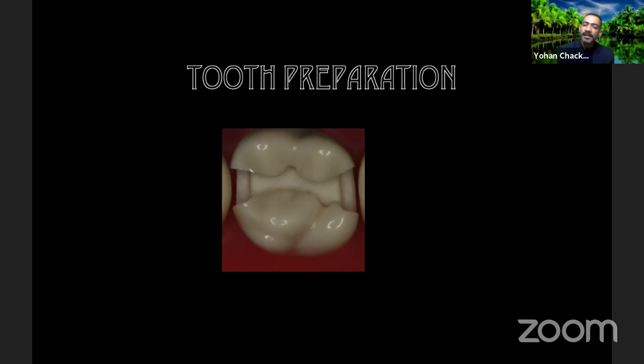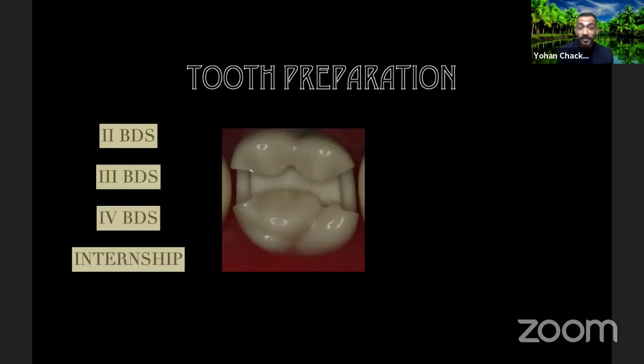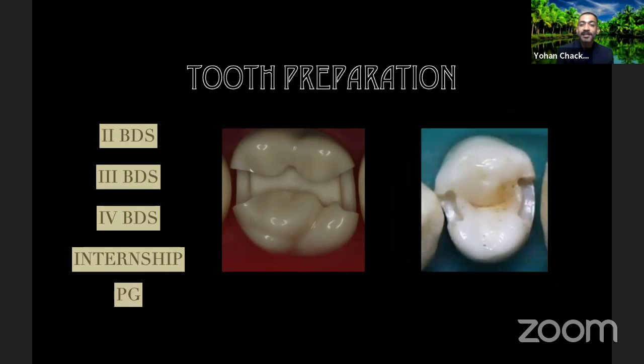If we look at this particular preparation, we will remember this from our second BDS, from third BDS, from final BDS, from internship. And maybe when we join PG, we make it a little minimal. But the fact remains that the style of preparation hasn't changed much since Black's cavity preparation style. Now, if you look at this particular picture over here, you will see that it's still a box. And this particular picture over here is still a box. Now, this particular design was designed for amalgam in mind.